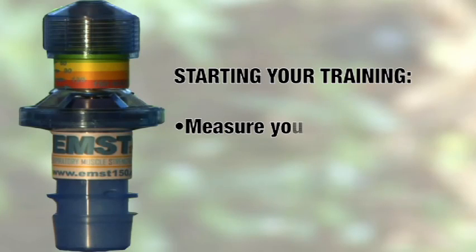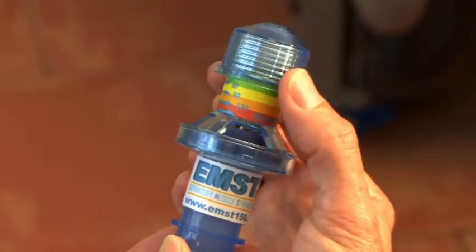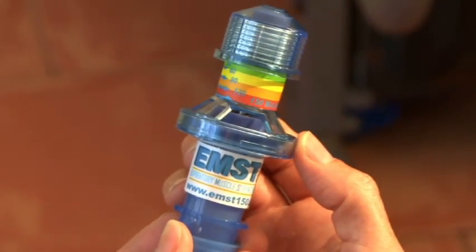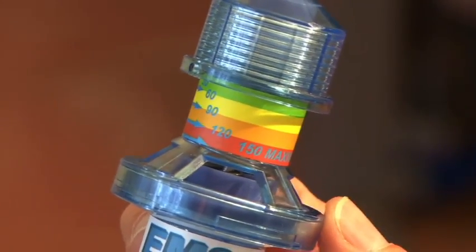Now let's determine where to start your training. The first step is to measure your maximum expiratory strength, and you can do that by simply using the device. First, place the nose clip provided with your package on your nose. Next, turn the blue knob on the EMST 150 until the small screw on the bottom of it lines up with the number 30.